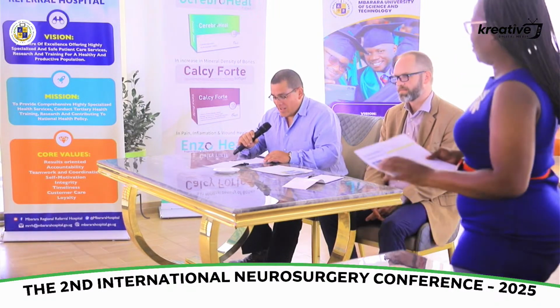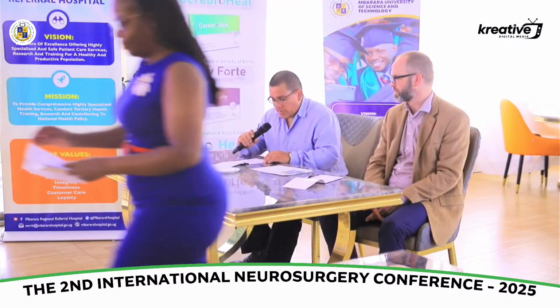Okay. And another comment about what Dr. Ormond was mentioning about AI applications for transcranial Dopplers. AI is in the process as well. Andrei Alexandrov at the University of Arizona has developed a continuous TCD monitoring with the purpose of machine learning to identify vasospasm in real time. So that's something that hopefully in the next few years will come up.